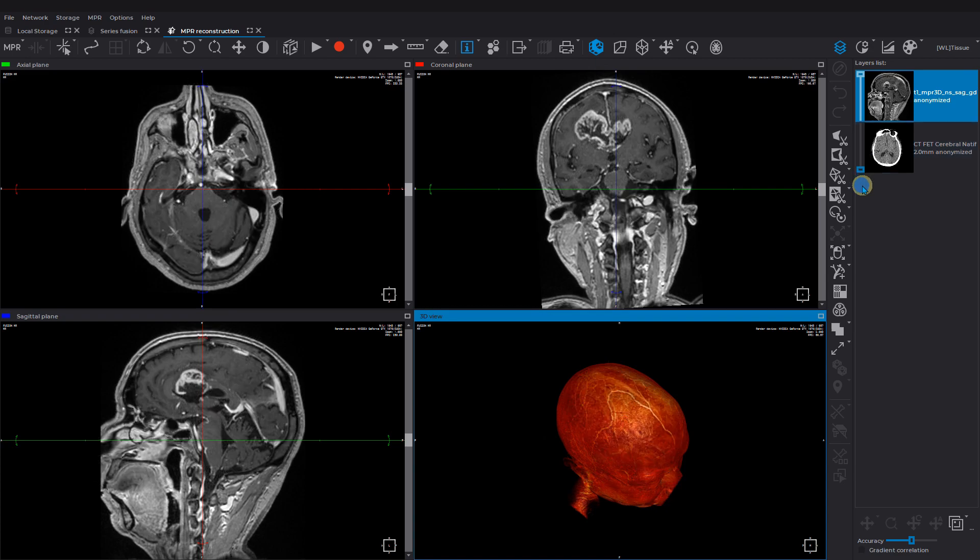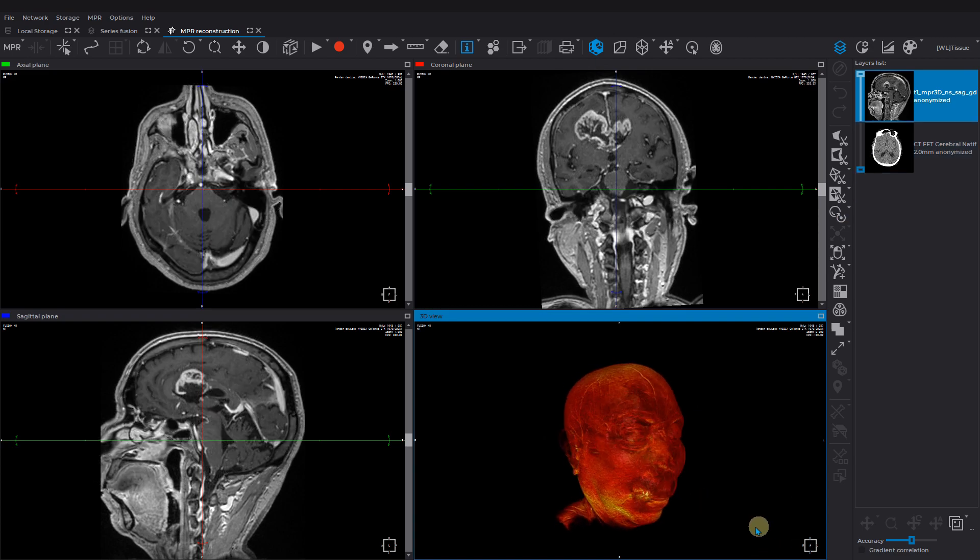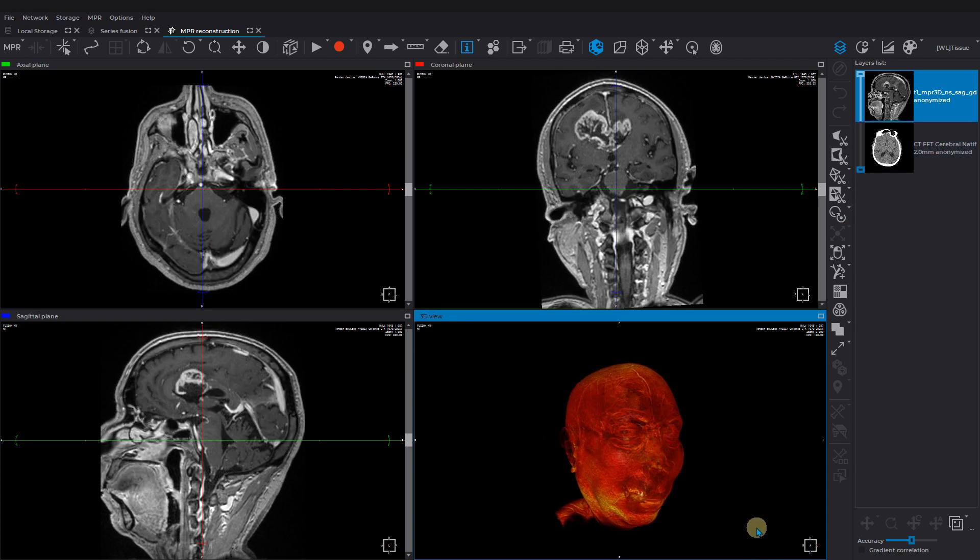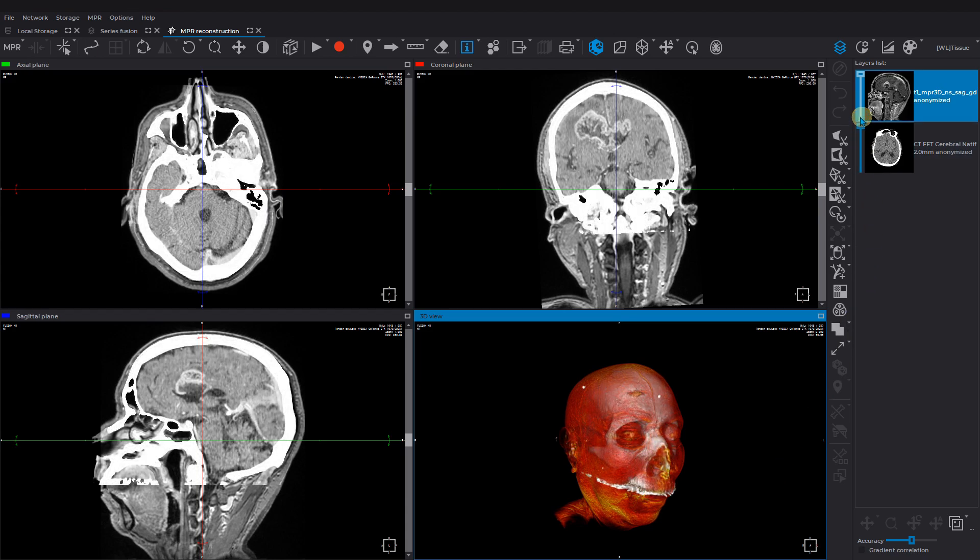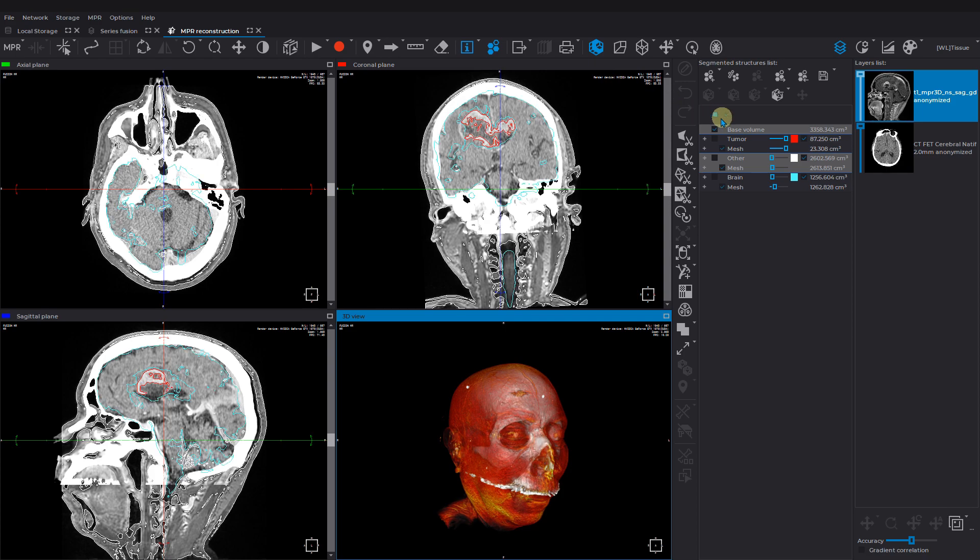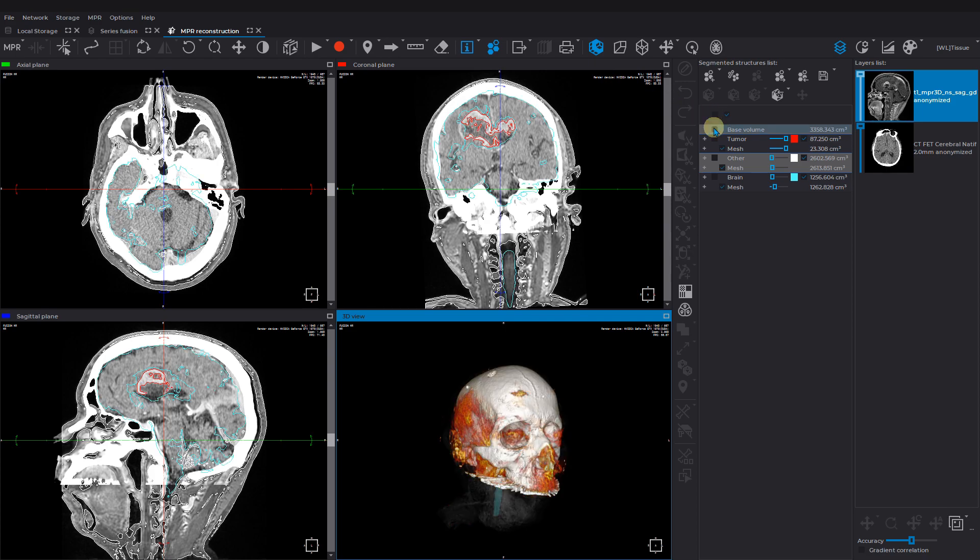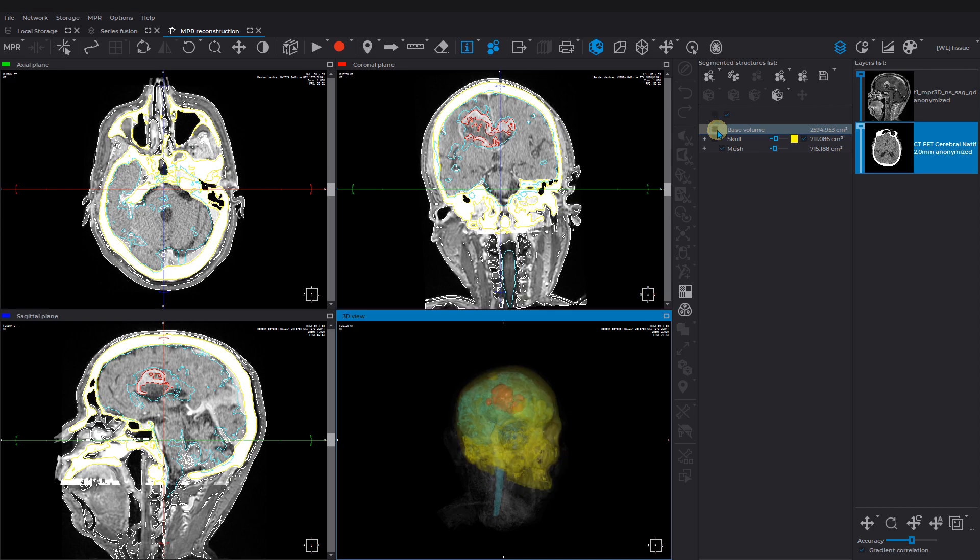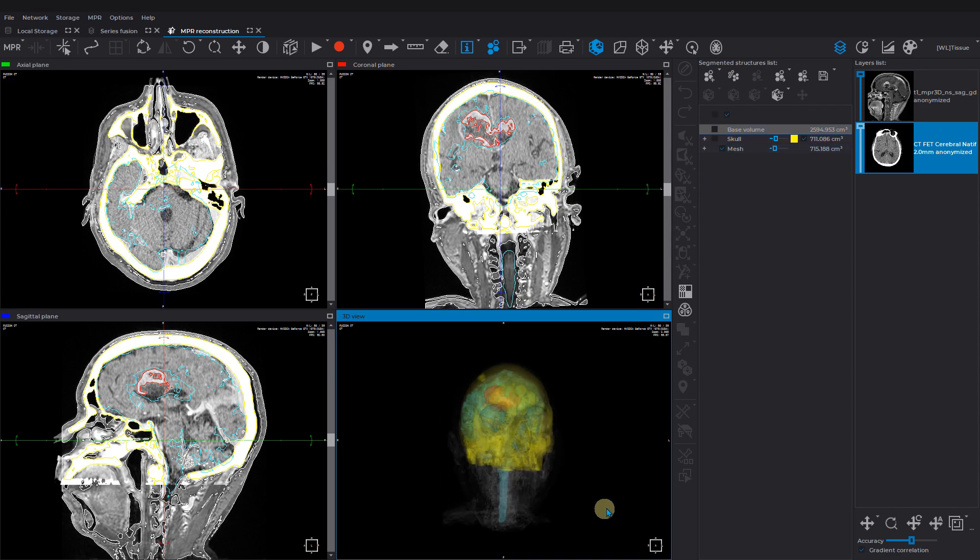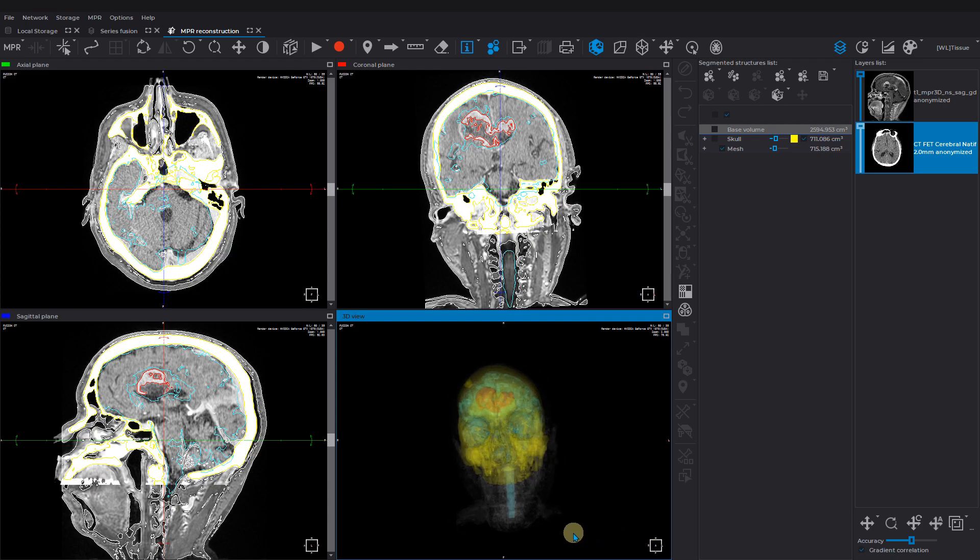The series fusion allows you to obtain 3D reconstruction for the registered MRI and CT studies. We have previously segmented the related structures for this video. There are a skull, a brain, and a tumor. On the reconstruction of the registered series, you can better plan the surgical access to the tumor.